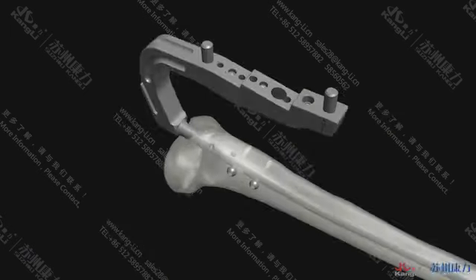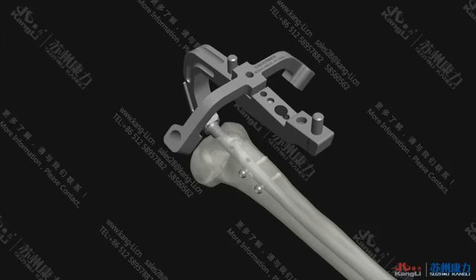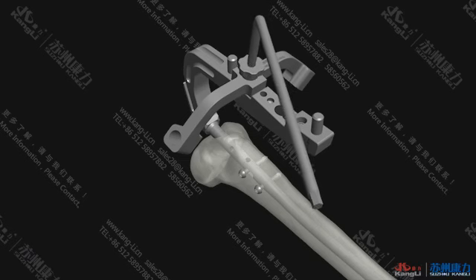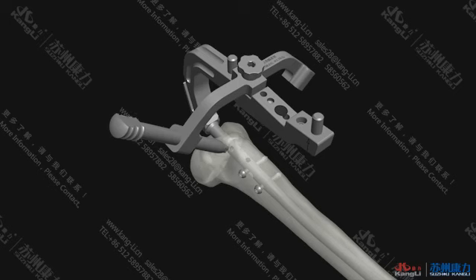The detailed operations are as the following. Install the proximal cancellous bone targeting bracket on the holder and screw tight with the proximal targeting bracket lock wheel. Insert the cancellous bone screw sleeve combination into the first oblique locking hole. Keep inserting the cancellous bone screw sleeve combination until it reaches the bone cortex.